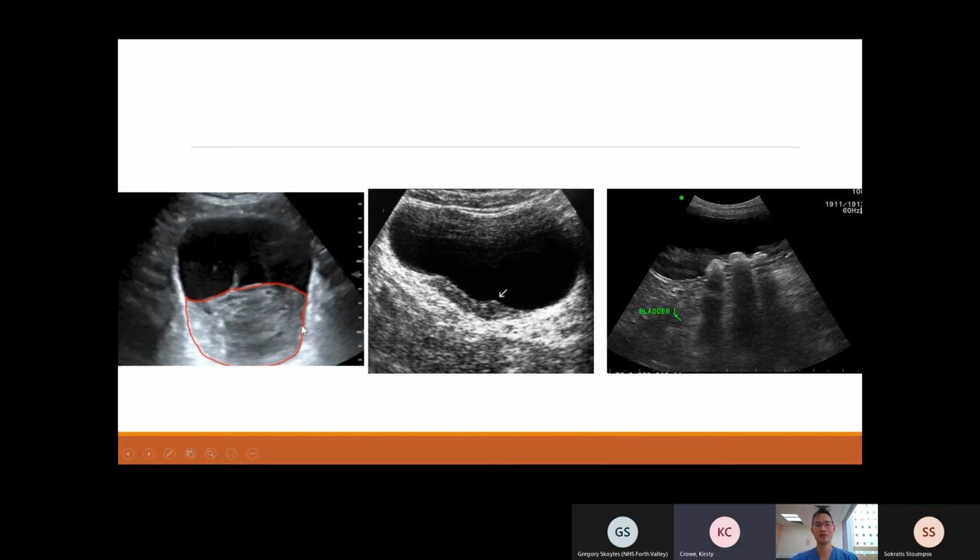Oh, so when you have blood that's congealed and coagulated, it often forms a very disorganized structure. And so this here is a bladder hematoma. So if you have a patient that's not able to pee, and he's got urinary retention, and you scan his bladder, and you see this, you know that he's probably got blood clots that are causing him to not be able to pee.